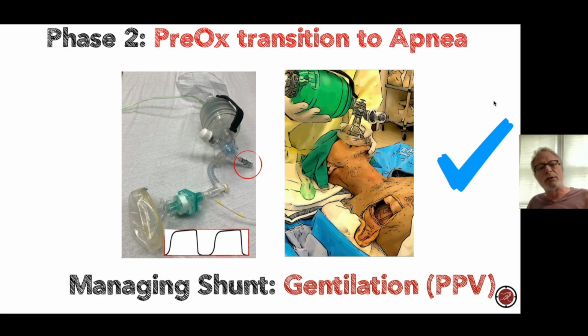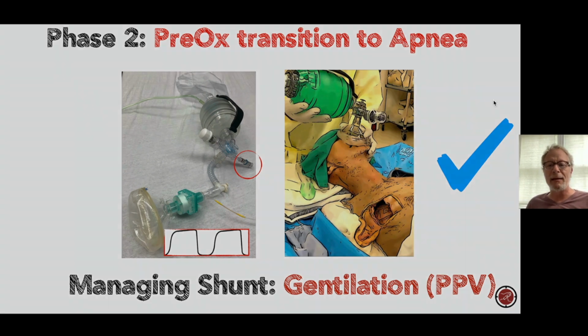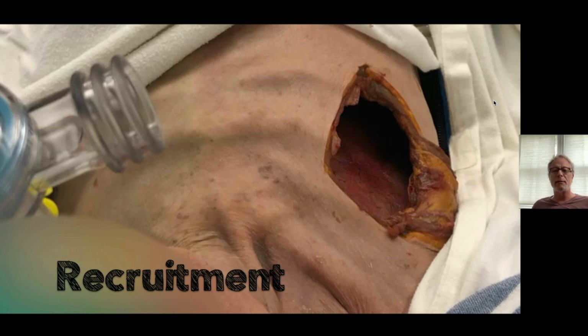So we're just using that gauge. We're keeping an eye on things. We're paying attention with the pressure manometer. We're paying attention, looking at the monitor, not necessarily for sats, but waveform. And we'll make adjustments as needed in that situation. I'm just going to show you about recruitment.